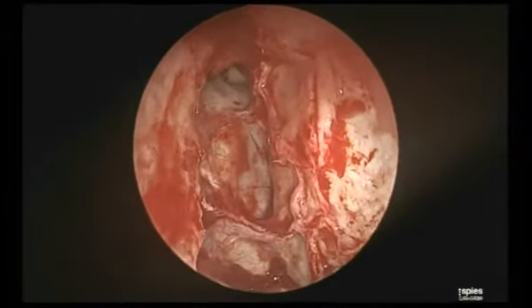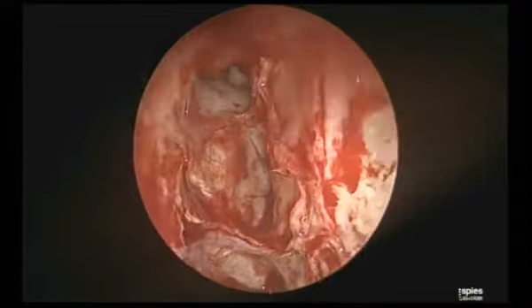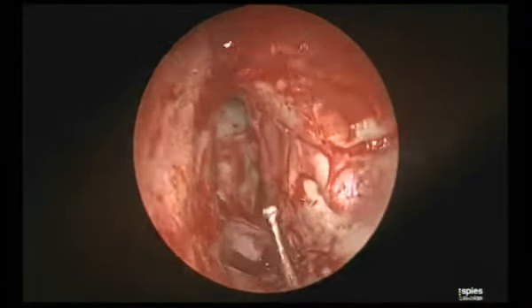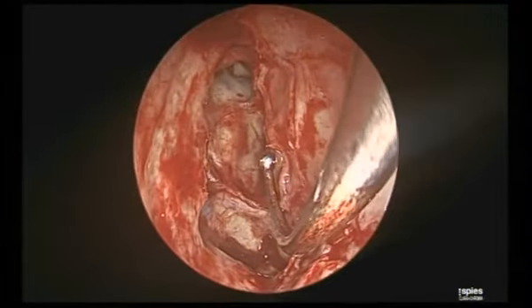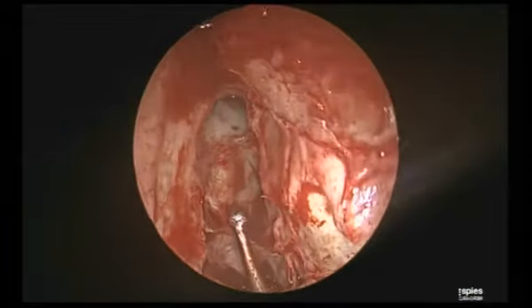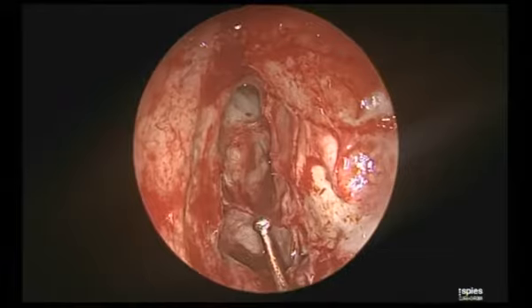So this artery is basically pushed by the over-pneumatization of the supraorbital cell, behind. So this is always variable. Sometimes the supraorbital cell is not over-pneumatized. You may have a small fovea, one cell over it, and the anterior ethmoidal artery would have been here. So the location of the anterior ethmoidal artery from this point of view is variable.